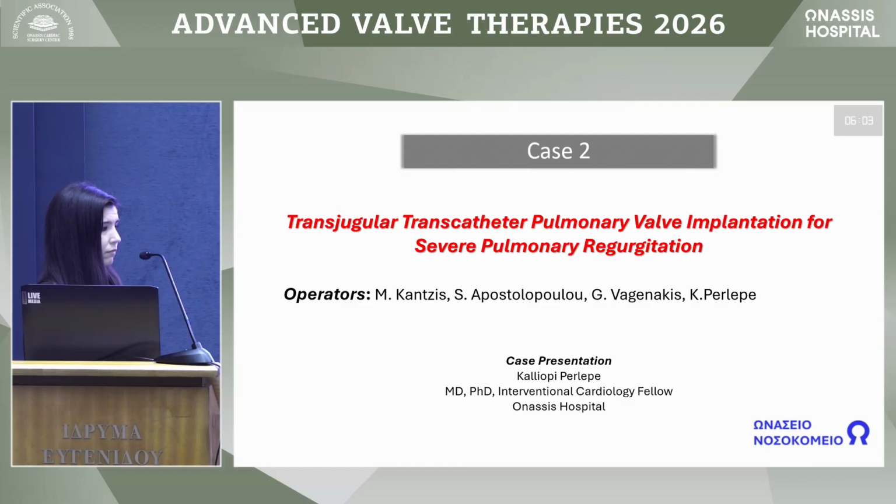Okay, that's interesting. We have Dr. Mariano and Dr. Sparias. Would you crack an aortic valve in that fashion?